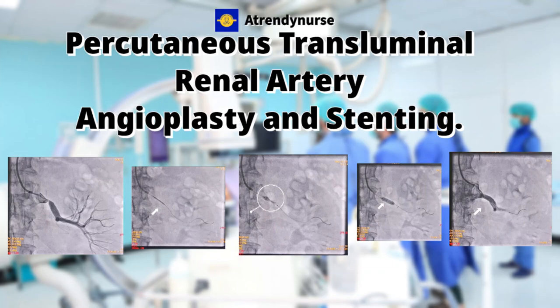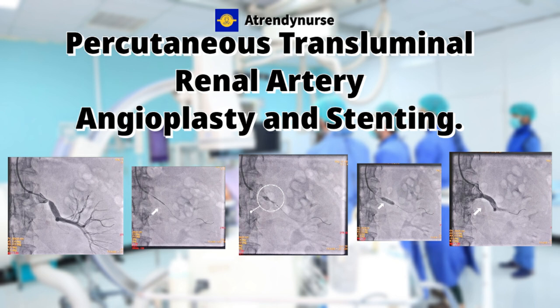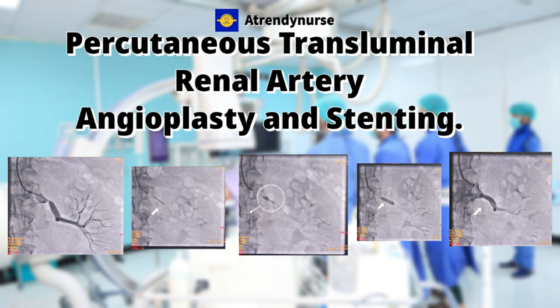Hello everyone, today we are going to discuss about renal artery stenting and stenosis, and we'll see how they will perform the procedure in the cath lab. Let's get started with the introduction.